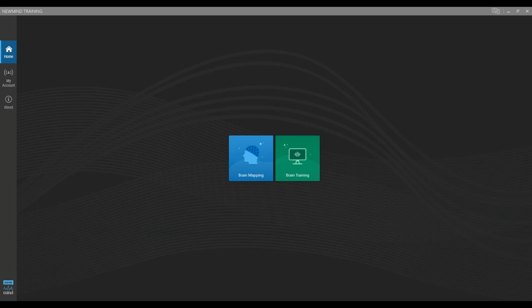I mean, with the NewMind software, I would do my best to try to figure out what's going on, but we all know we get those clients that, for whatever reason, their muscular system, something's going on that we just get constant issues either on one side or both.